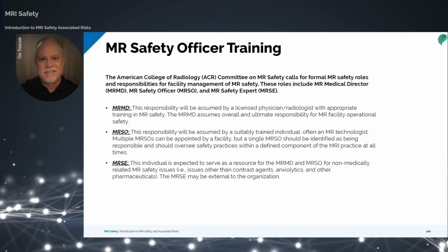Then at the technologist level, the MRSO, this person is a suitably trained individual and has passed the certification board exam from the ABMRS. Multiple MRSOs can be appointed by a facility, but a single MRSO should be identified as being responsible and should oversee the safety practices within a defined component of the practice at all times.